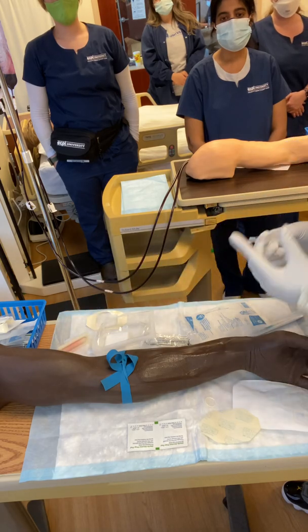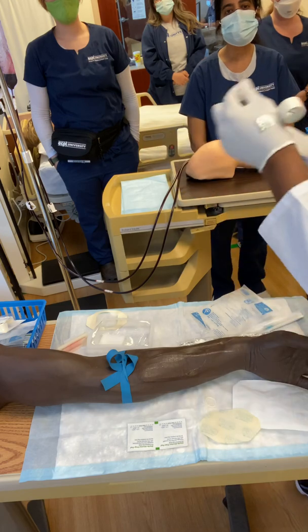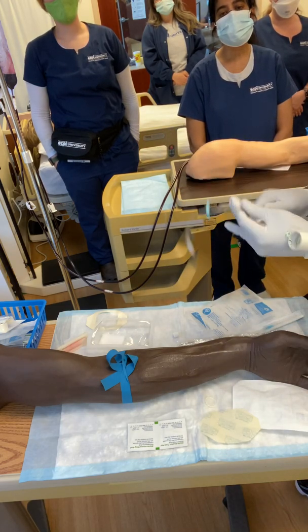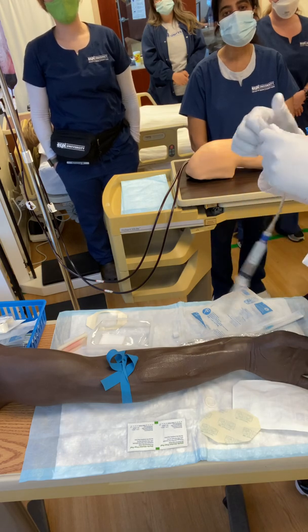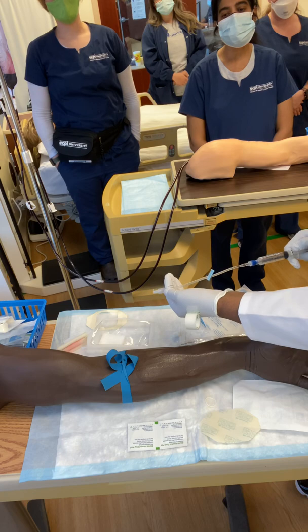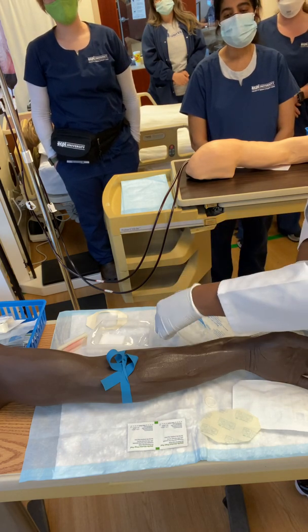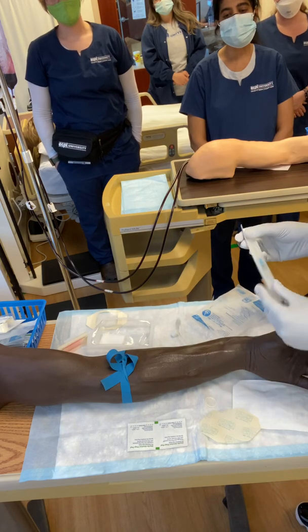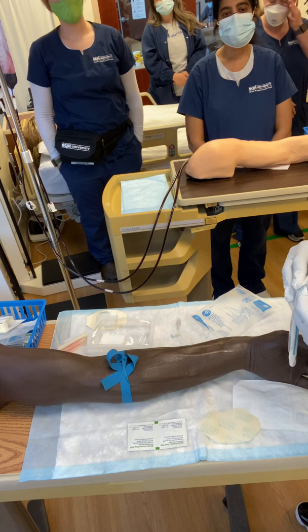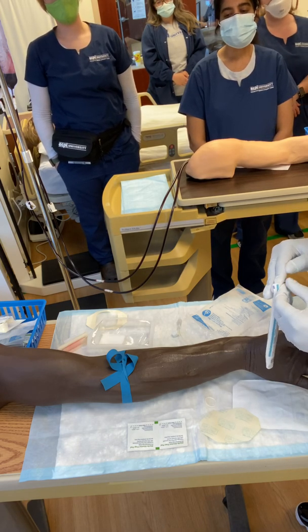Okay, so then what we do is connect our flush to the extension. And what I like to do is just go ahead and activate it so we prevent any air from going to the patient. Very important. Alrighty, so let's go ahead and get started. So we have applied our ChloraPrep. Let that dry a little bit.